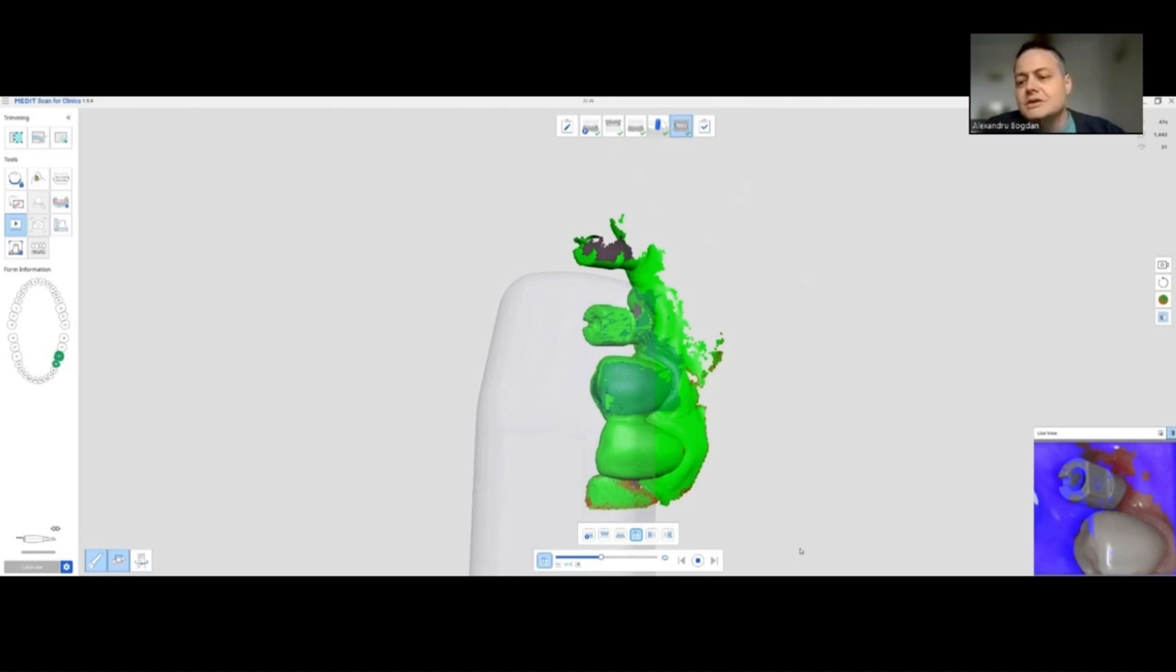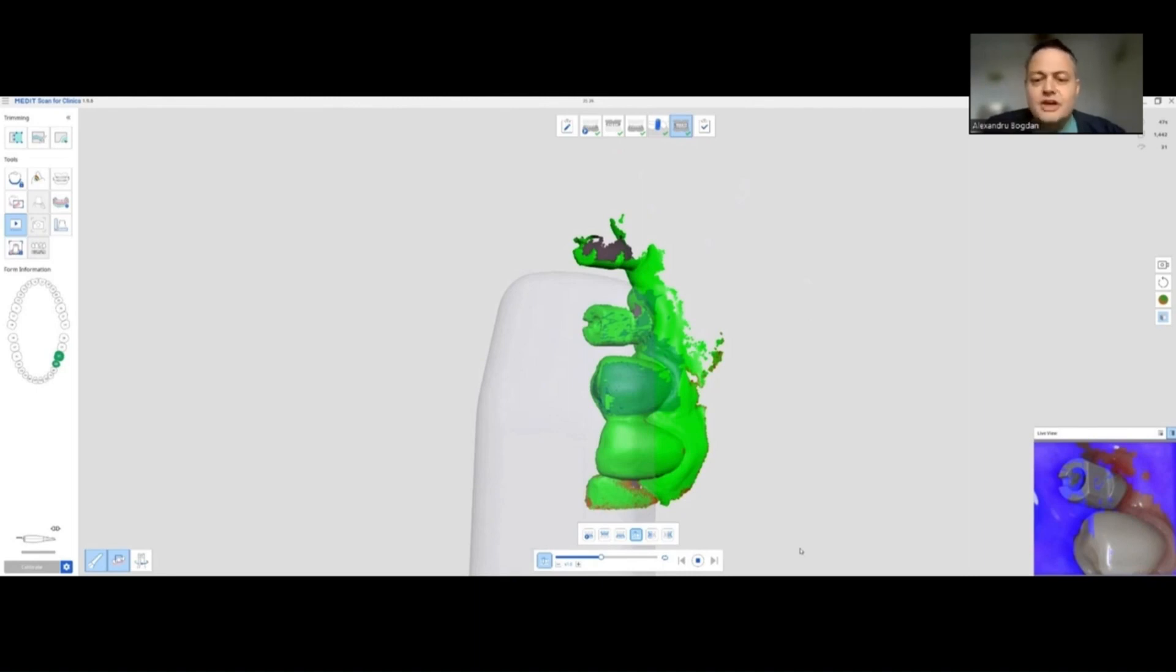Keeping this mesial teeth there, and this way I have both distal scan bodies imaged on their vestibular, mesial and lingual sides.